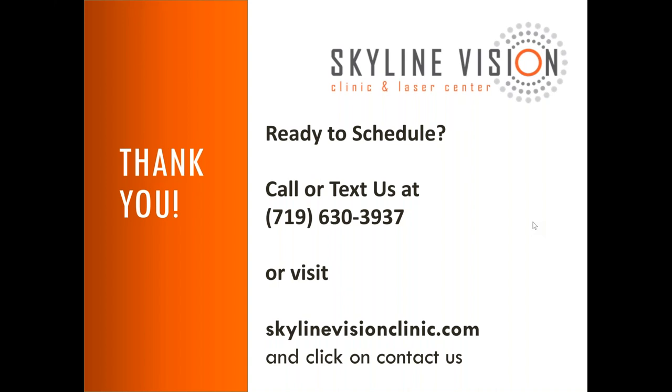During our annual visits, we look for the formation of this posterior capsular opacity. If there is one that has formed and is reducing the vision, then we perform a procedure called a YAG capsulotomy. The YAG capsulotomy is a very quick procedure where a laser is used to open up that film in order to restore the vision. The laser will take between 5 and 10 seconds. It's covered by insurance. Once that laser is performed, that film does not return.